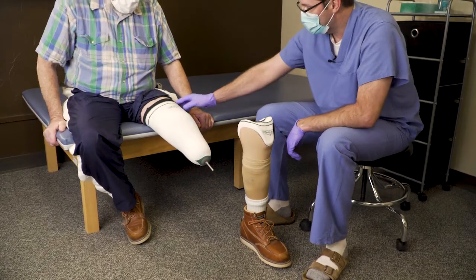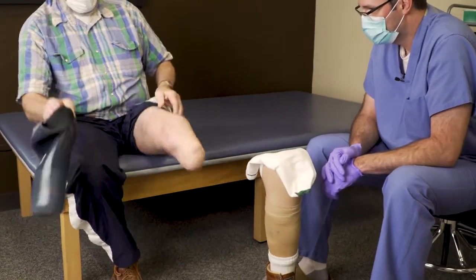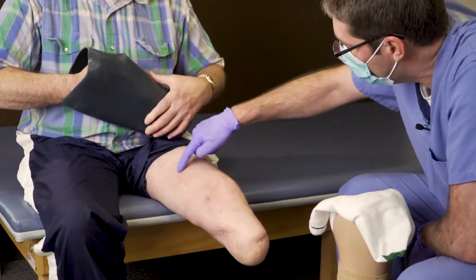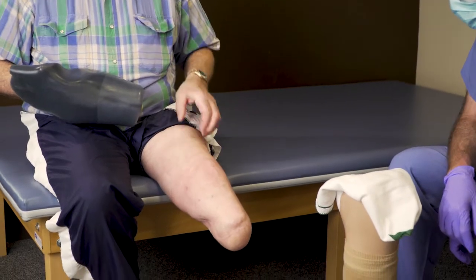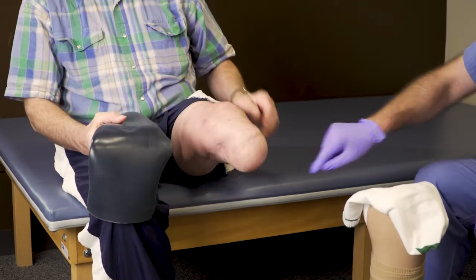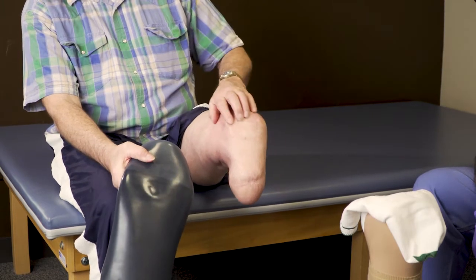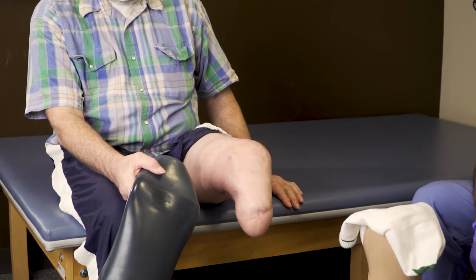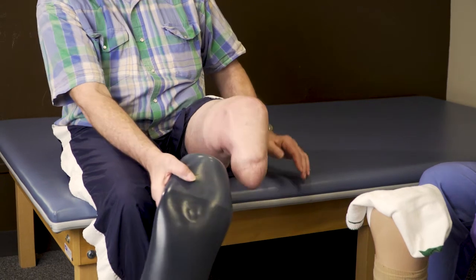So can we take a look at your leg and have you show people how to put everything on and off? So he's got a gel liner. The surgery was here and mostly along this side. There's a plate here and there's like 14 screws in there. Well, your limb looks really good. Do you get sores or anything like that from time to time? Just that it gets dry and like a rash in here, but you told me to put hydrocortisone cream on, spray it at night with the antiperspirant, and it works fine. Good. Well, everything's looking good.